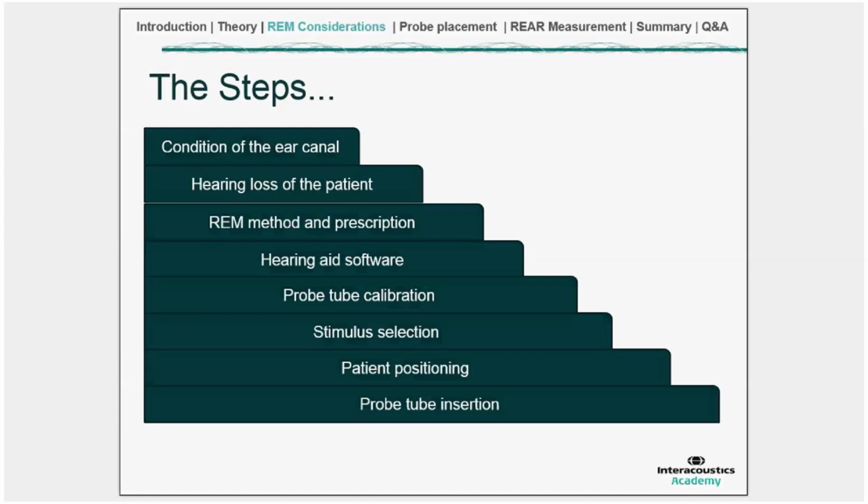So all these steps, although there are quite a few of them, in clinical practice only take a couple of minutes or even less to actually perform. And I have videos for each of these steps, and we can go through those now.